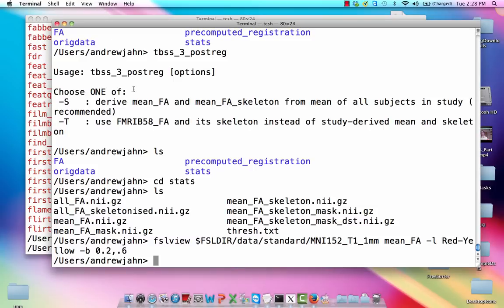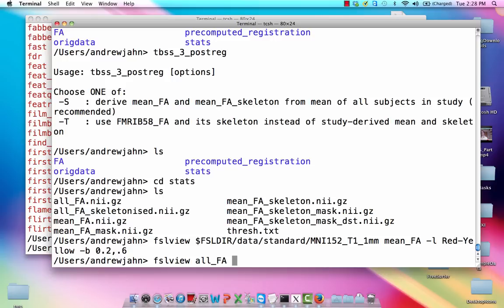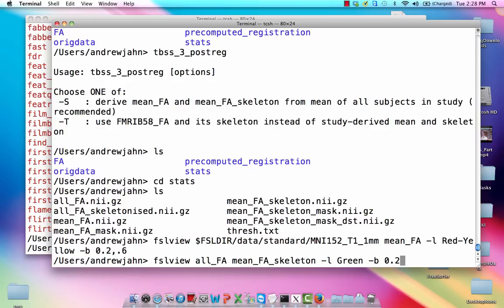And the last thing that we're going to inspect from the output of the TBSS3 command is this merged image of all the FA maps. So we simply merged all the FA maps of all these different subjects in our study. Here it's only six people, but you would do it for everybody in your own study. It could be a lot.